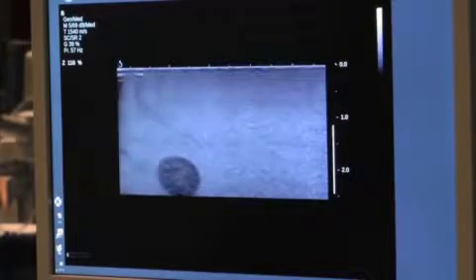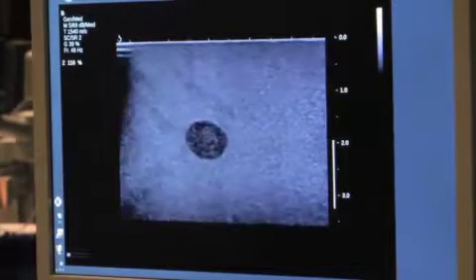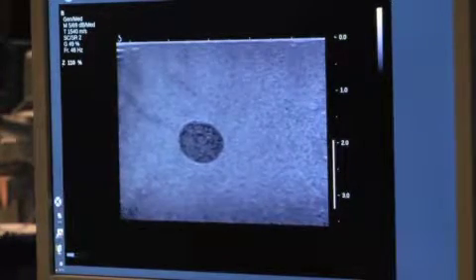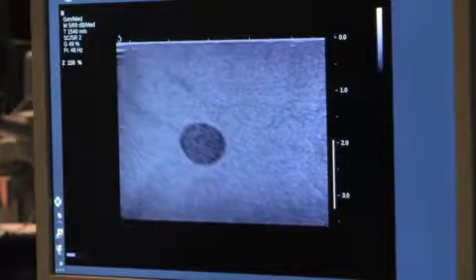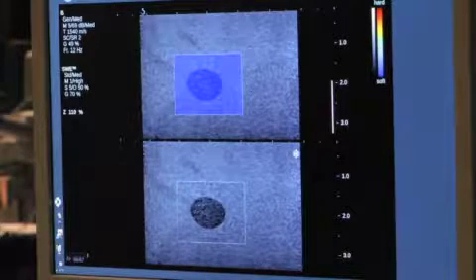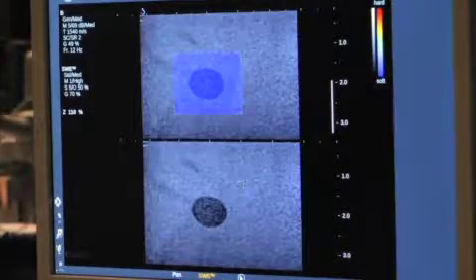In contrast, I am going to demonstrate a soft lesion. I am just going to adjust my depth and move my focus down. It is very important to have optimal 2D image quality before entering shear wave mode. This lesion appears somewhat similar to the other lesion in that it has a complex appearance with different shades of gray. When I activate my shear wave, I see that in contrast to the very stiff pattern of the other lesion, this lesion is soft as compared to the surrounding tissue. When doing shear wave, you always want to compare your target or lesion to the surrounding tissue.